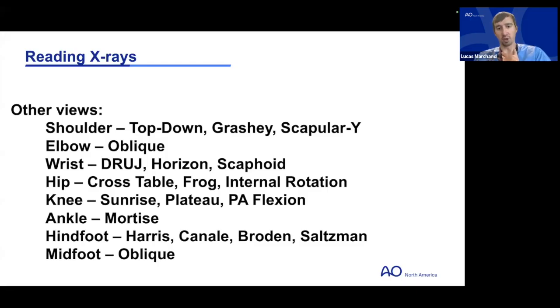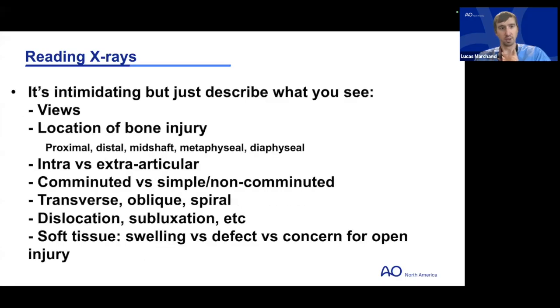Okay, and then in the midfoot, you typically get three views of the midfoot, one of them being an oblique, very similar to what you see in the elbow.